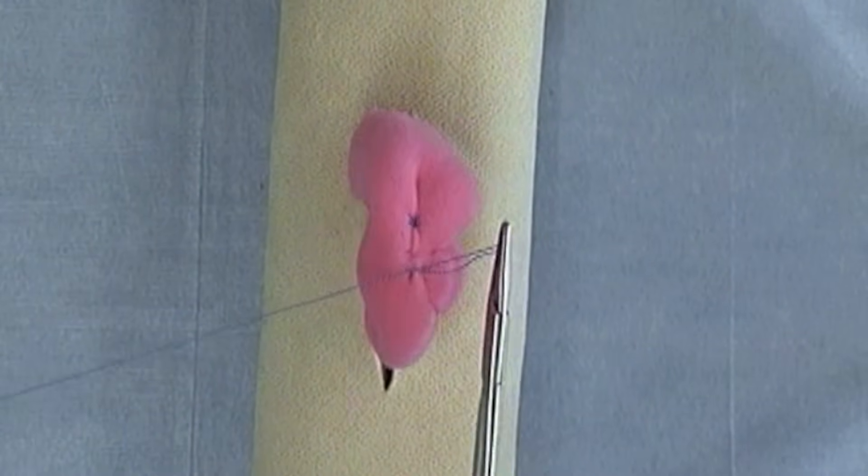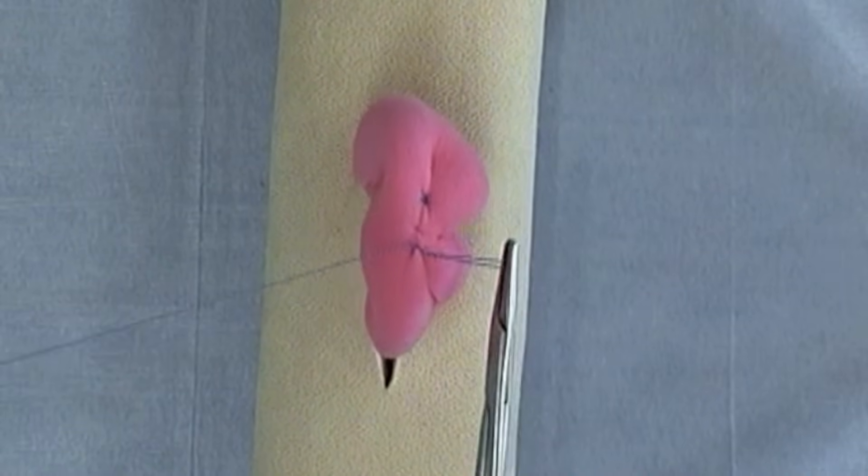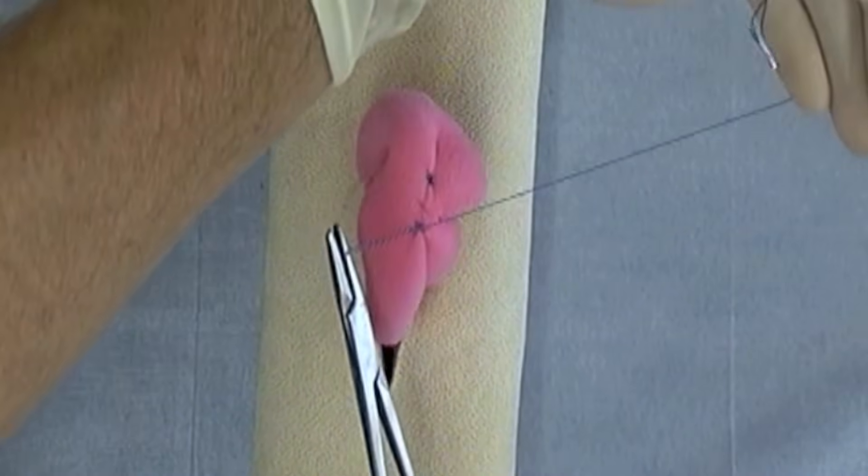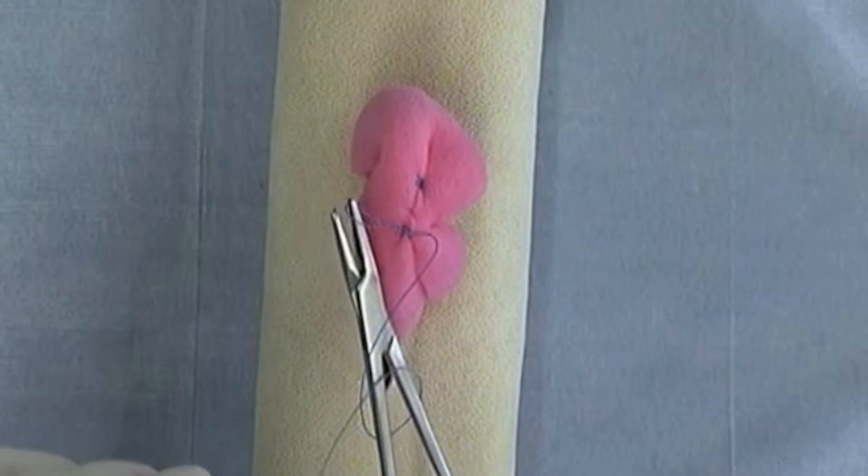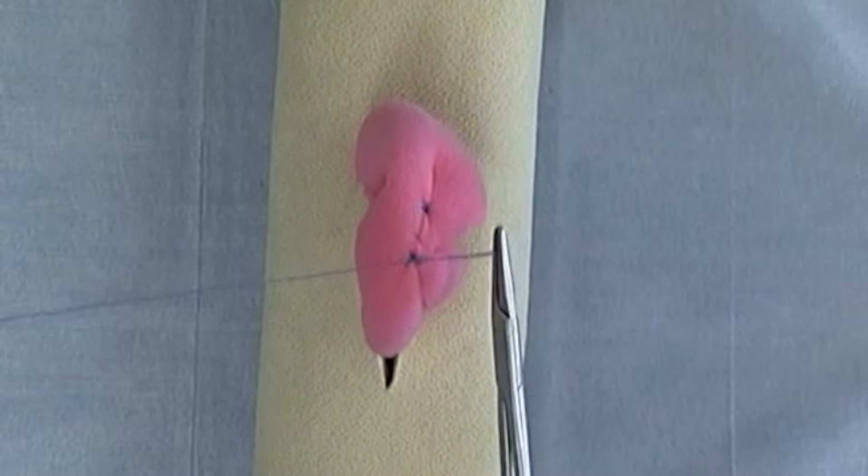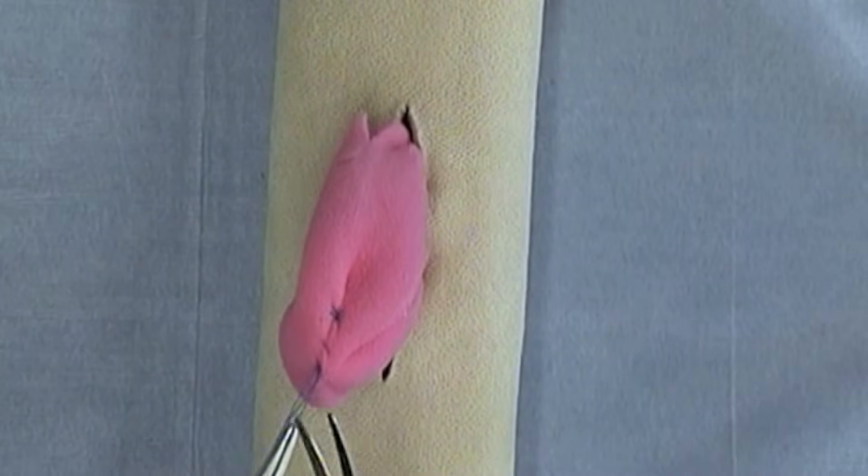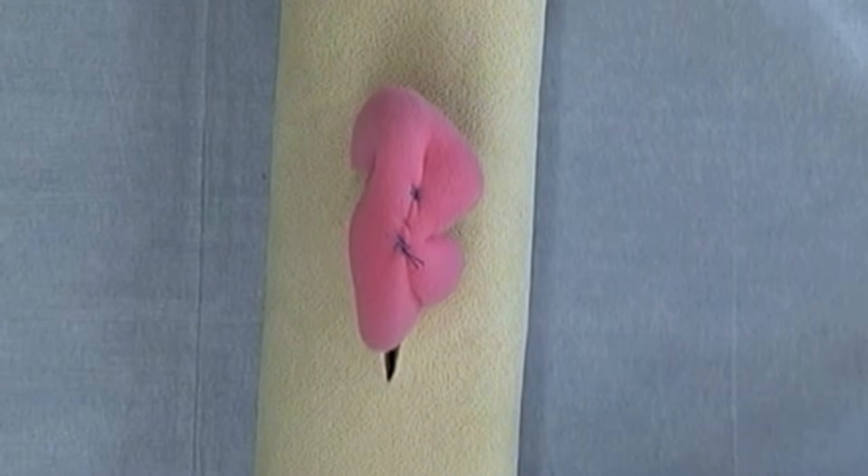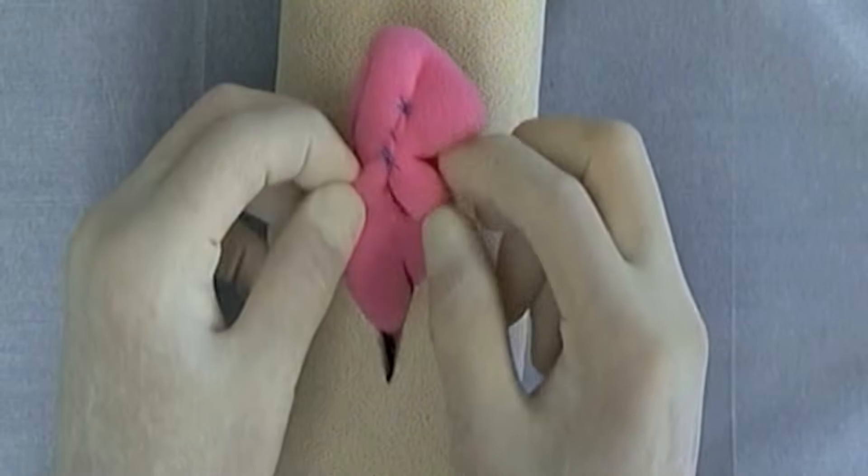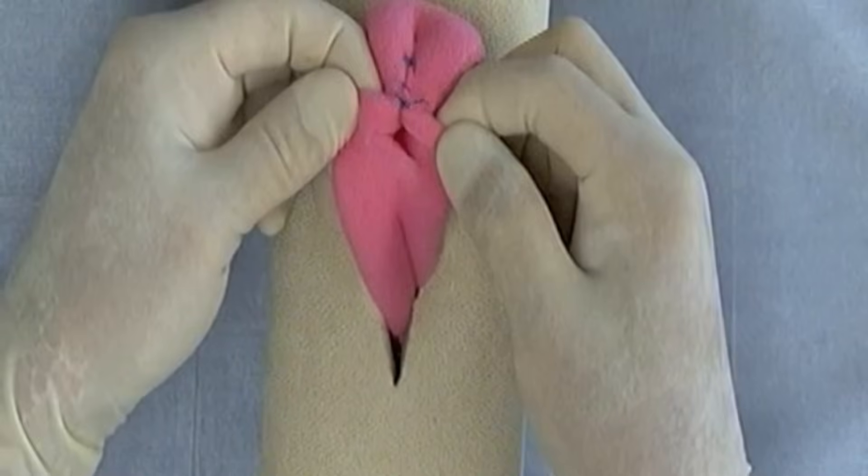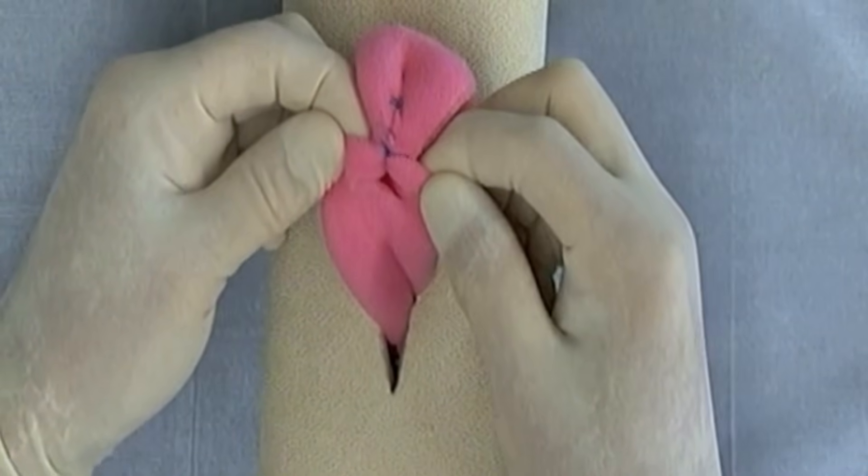So this was a continuous Lembert started by performing a Lembert suture and ending by performing a Lembert suture. And just to demonstrate you can see that this has inverted a substantial amount of the intestinal wall.